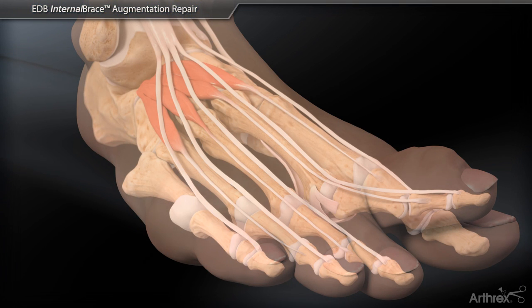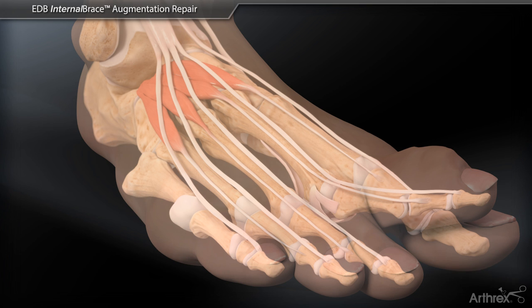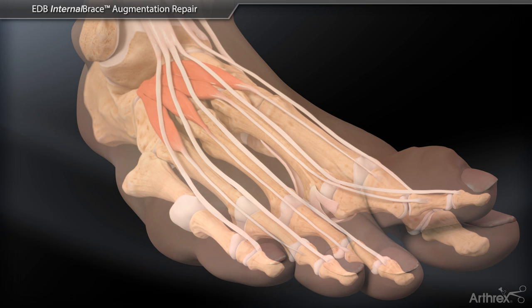Arthrix presents the EDB internal brace augmentation repair technique for crossover toe pathology.